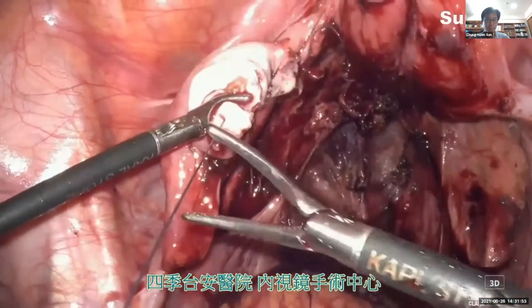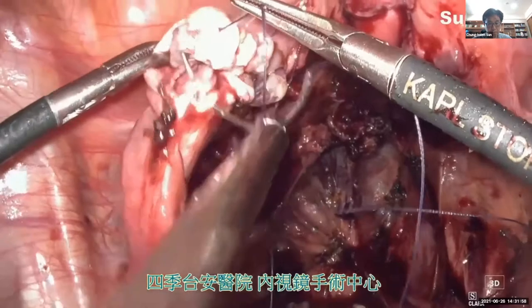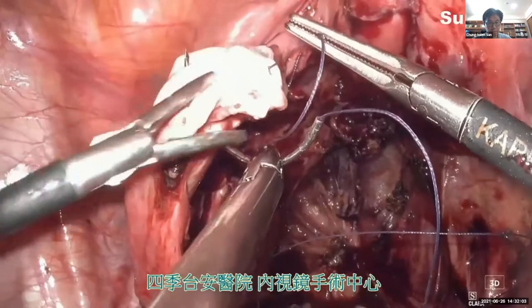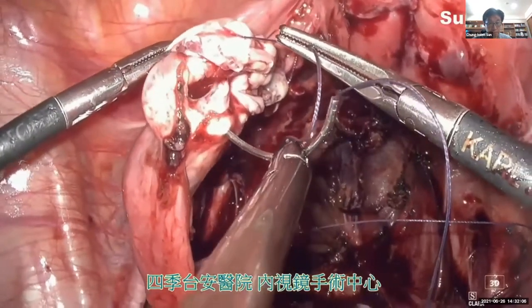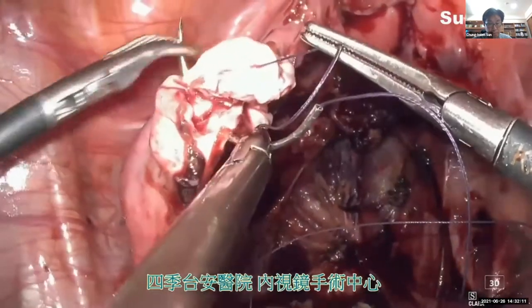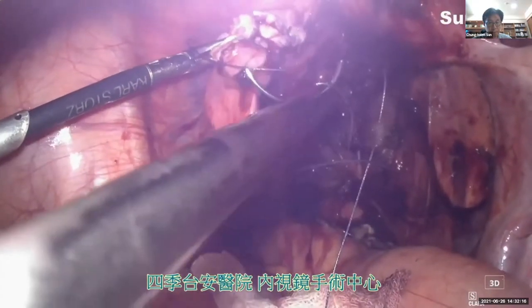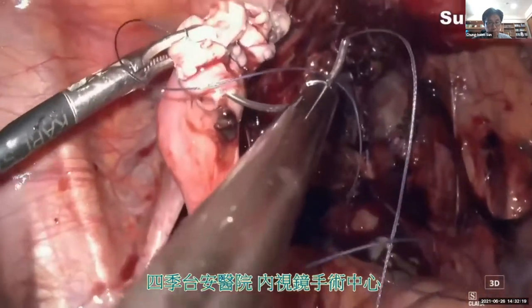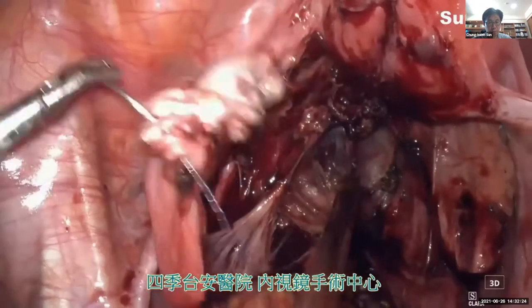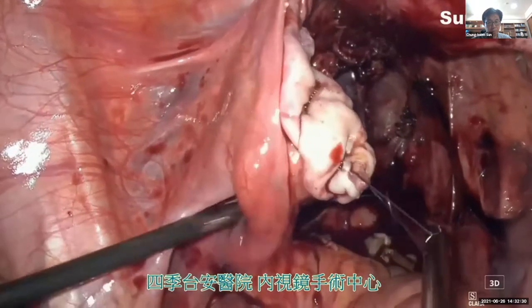Again, do not pull the string too tight. Our purpose is to reapproximate the ovarian tissue and do not strangulate the ovary. Okay, we have completed the ovarian tissue reconstruction, reapproximation here.